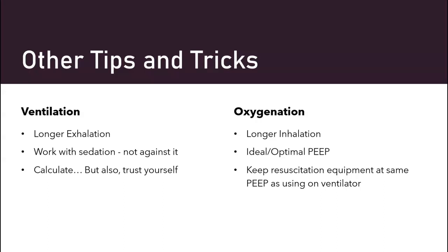Because I've been in situations where you go to grab the bag because they're de-recruiting or they're just not doing as well, and you go to bag and the PEEP is set lower than what you've had them on the vent, and they de-recruit, and it takes a while to re-recruit them. So that's just a little working-at-the-bedside life hack I'm sharing with you guys. I do that in newborn and I do that on the adult side. So that's just a little from me to you.